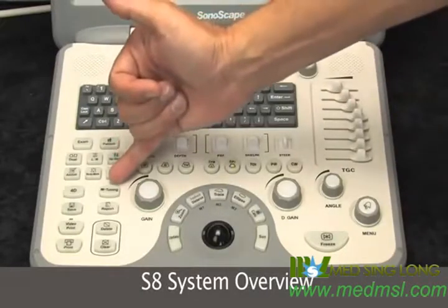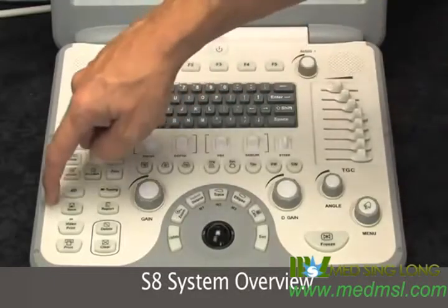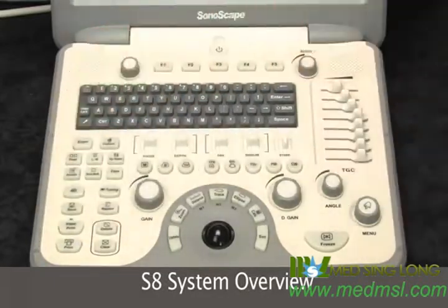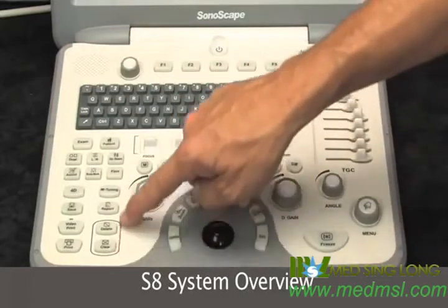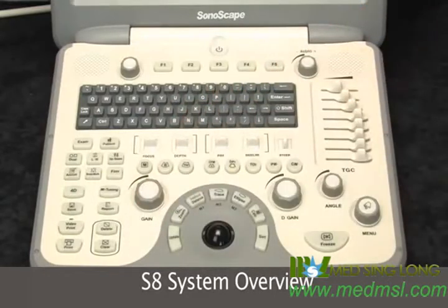M-tuning is the one-button image optimization for the system. Save video, print. This is how we store our images, and our reporting. Deleting and clearing has a circle around it so you can be careful not to do that by accident.